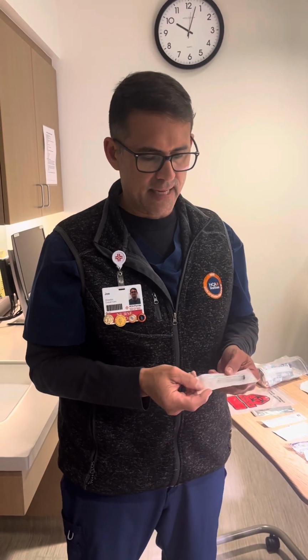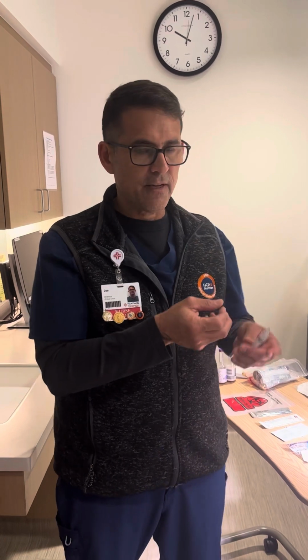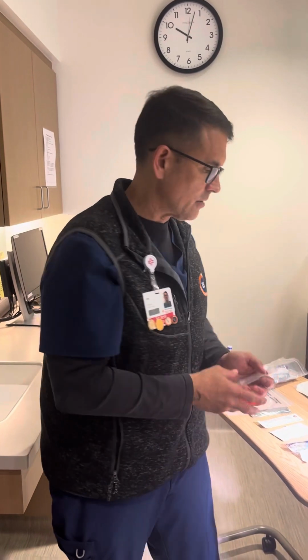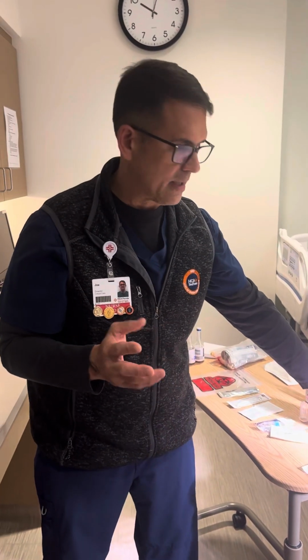If they have a 24 gauge, you should never try anything bigger than a 3 ml syringe. And if you cannot get the blood by very, very softly pulling on it, just don't get it. Poke the kid again, because that blood is not going to be any good. Anyway, talked enough about hemolysis. That's one of the big reasons why blood gets sent back.